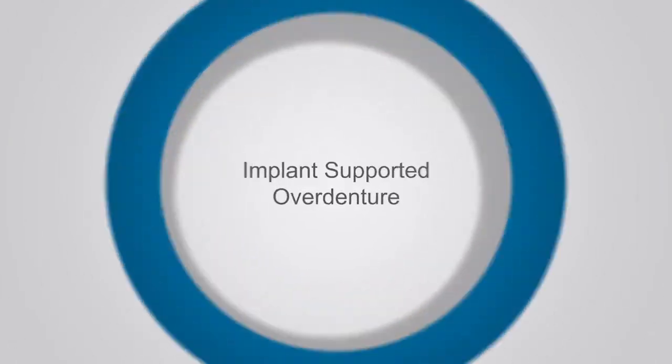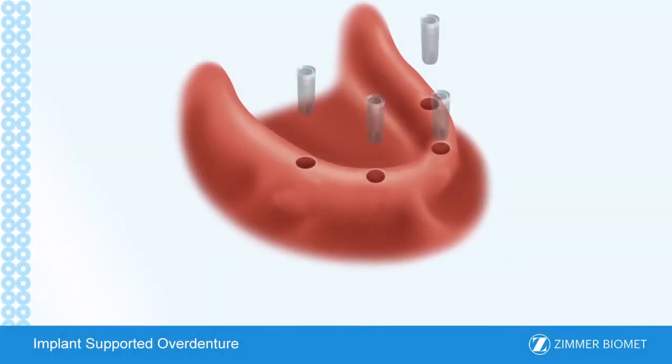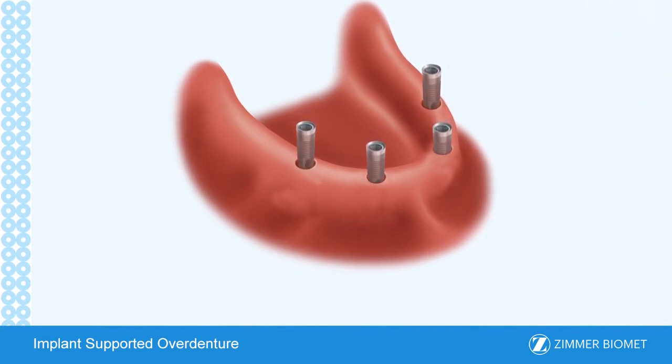Implant-supported overdenture. An implant-supported overdenture is used when all teeth are missing in the upper or lower jaw. This is an alternative treatment to the traditional full denture, which rests on top of the gum tissue. In this procedure, multiple implants are placed. The implants are typically left to heal for a few months. Exact time will depend on the quality of the bone where the implant is placed.